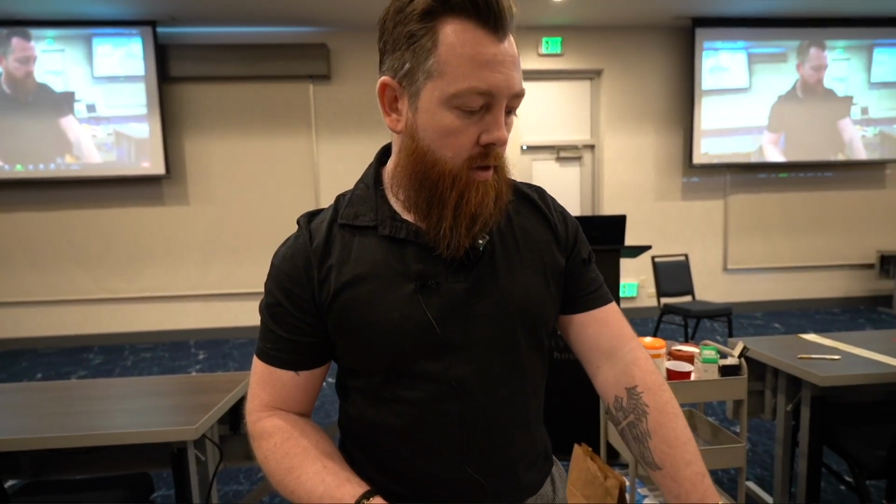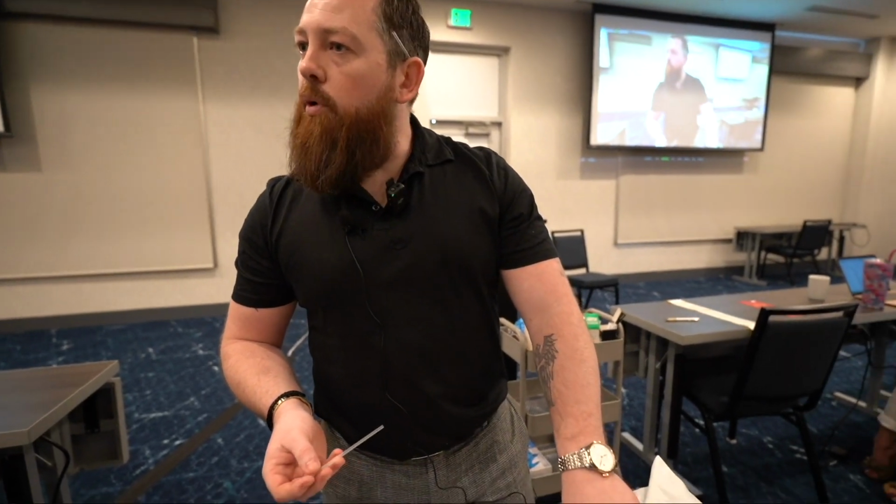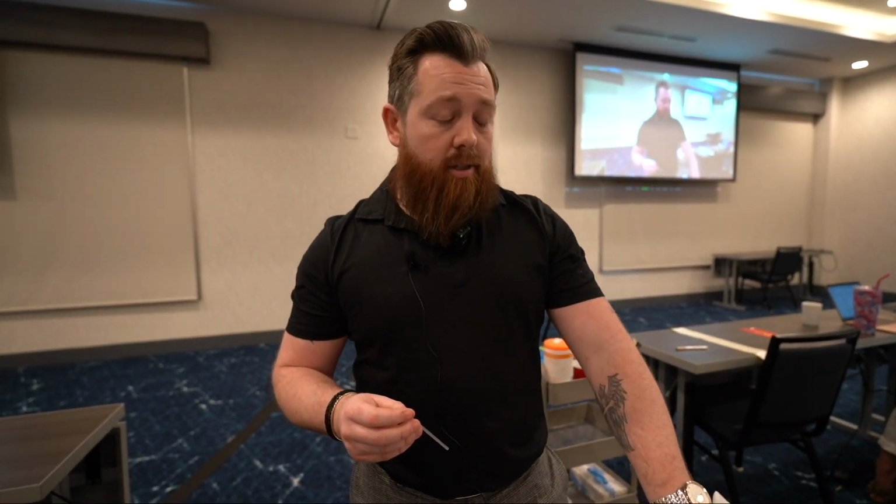Would I do motor points? Yes, I would. Absolutely. So I would add them. If there's trigger points, I will definitely hit trigger points and then do motor points. So in terms of motor points, I'm looking to re-establish the firing sequence of those tissues, neuromodulate, as Anthony says. In terms of trigger points, I want to restore the elasticity back into the tissue, do away with that noxious stimulus that's coming from that trigger point. There is times you can do motor points and get away with not hitting the trigger point, but with traps and jaw, I find you kind of need to hit the trigger points as well.